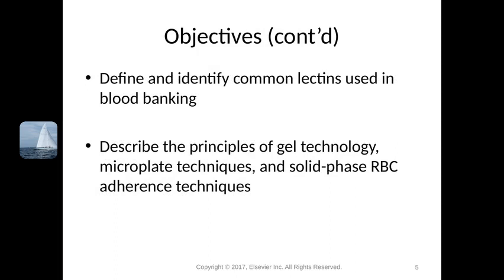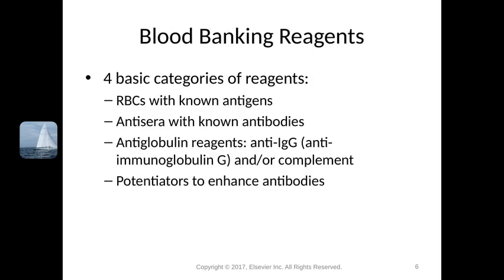And what are the lectins that we use within blood banking technology, and then some of our automation, gel technology or microplate techniques, and some of our solid phase capture. As we get towards the end of this course, I have a lot of PowerPoints on solid phase capture. When I was a supervisor, we instituted this technology within the blood bank that I worked at and ran. We used solid phase capture, which was really cool and very fun to use. But typically we're going to see the gel technology being utilized.